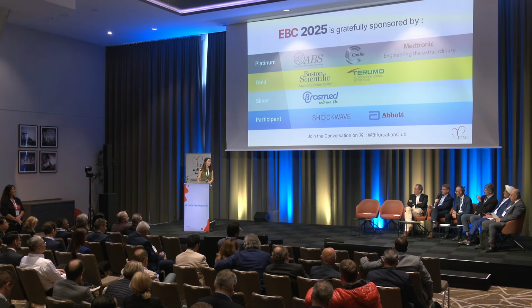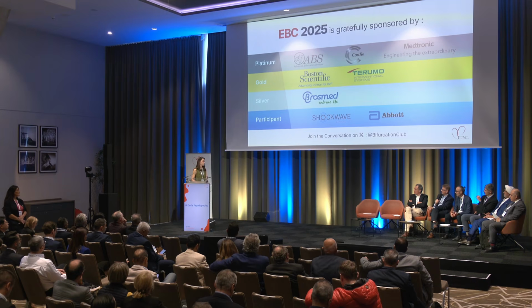Maybe one more comment regarding DCB. You prepped the lesion so nicely, and the result was so good angiographically that I would even try to treat the whole thing with just DCB without stent. Of course we don't have big data. We did have a small dissection there, but I guess it would still be okay to treat with DCB. But we don't quite have the evidence for this yet, so we are reluctant given the lack of evidence.